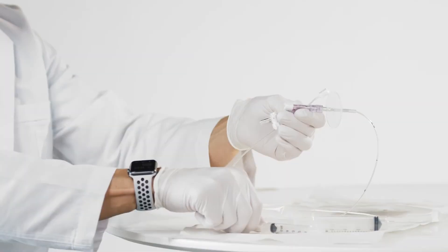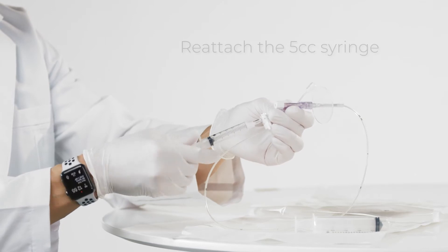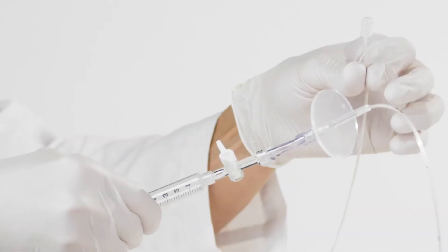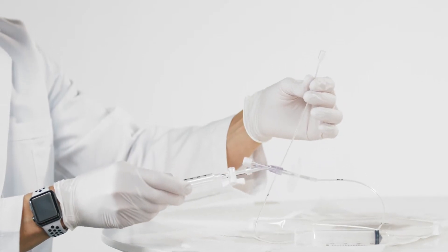Re-close the stopcock and replace the fully primed 5 cc syringe. The device is now properly prepared and ready for administration. Ensure that the plunger of the 20 cc syringe is completely depressed to prepare it for pulling vacuum. Place the syringe within easy reach.